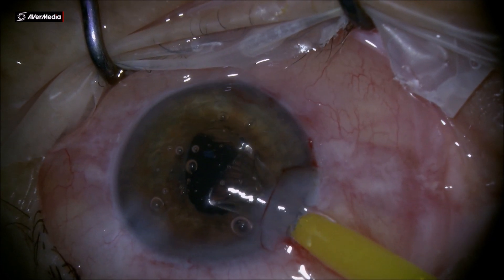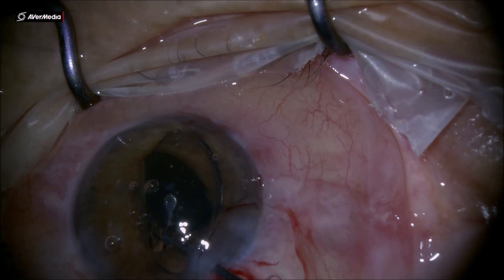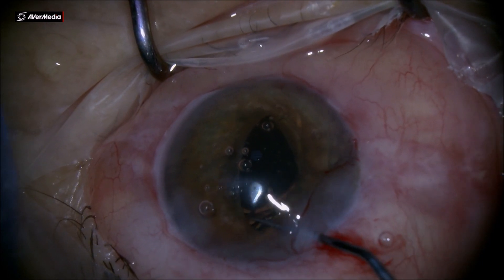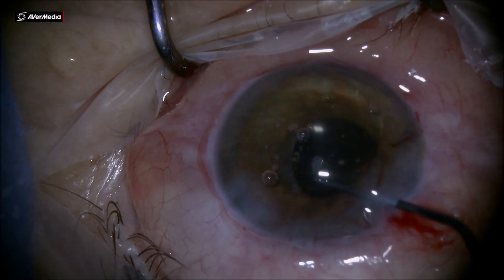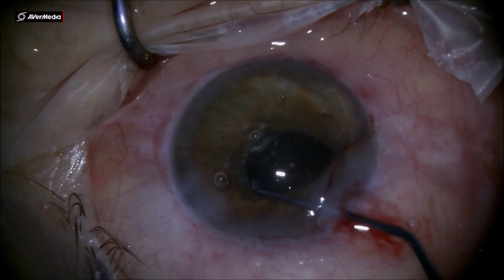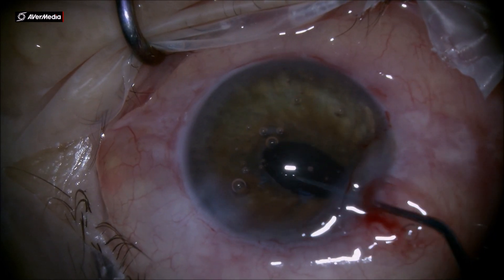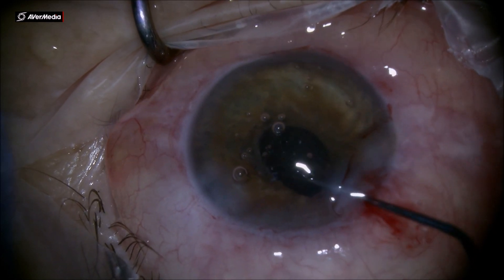This is a problem that sometimes can occur, but it's not the end of the world — any challenge can be solved if you find the right solution. Using the Mishev chopper with the spatulated tip, it's so easy to shovel the IOL optic back and forth and slowly rotate it. With lateral movements you can place it back into the bag from the anterior chamber, so it's not a big deal.